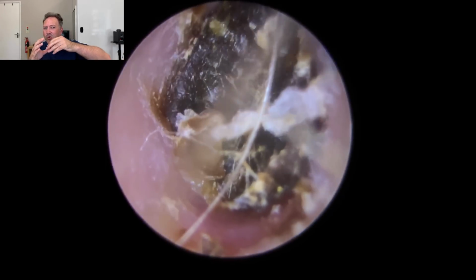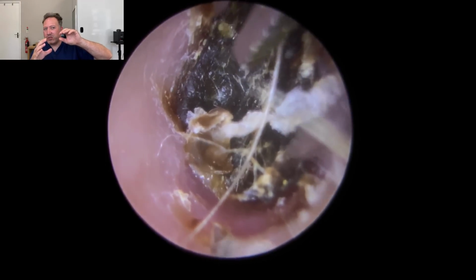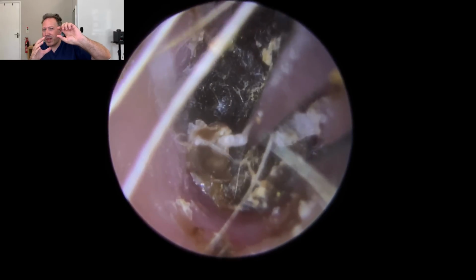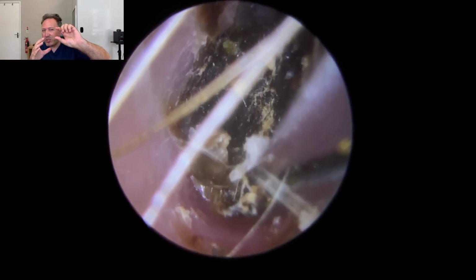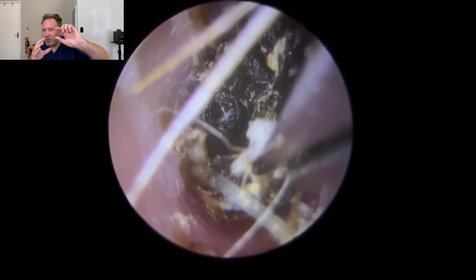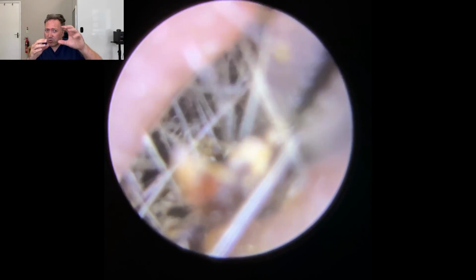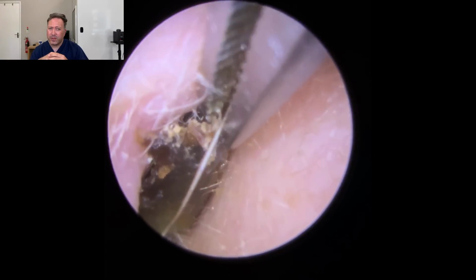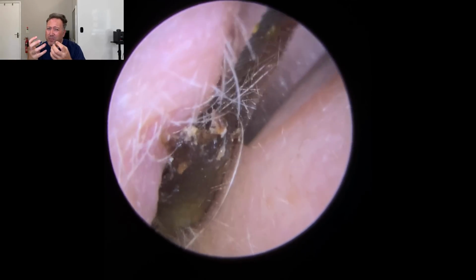So we've managed to lift the corner off now, so we're just going to slow this down in a second because we've got a nice leading edge to work with there. We're just going to very, very gently hold onto it here with the forceps and just pull. Do you see that whole thing slide away from that section? You can see how it was all held together, one big piece of wax here. It's very dry and brittle.